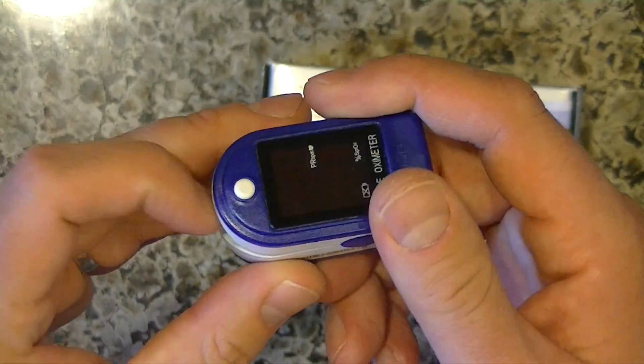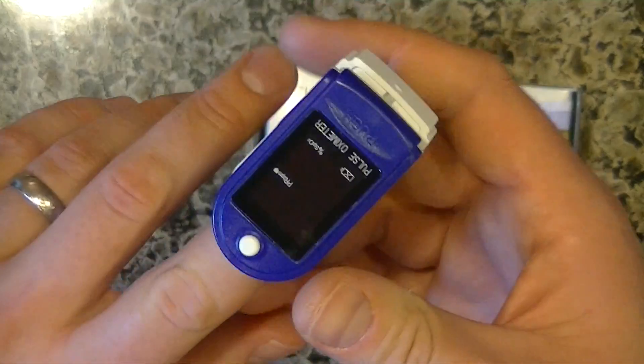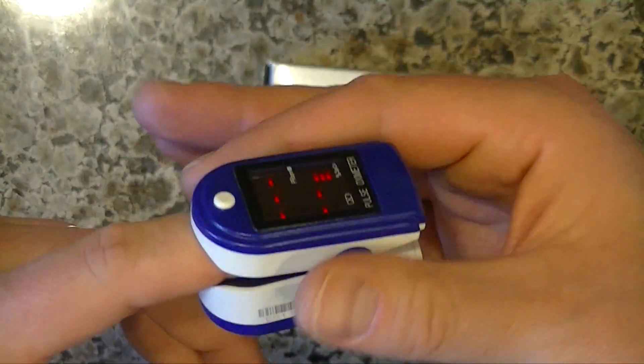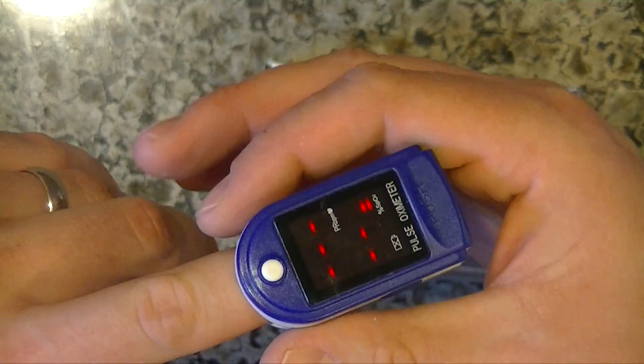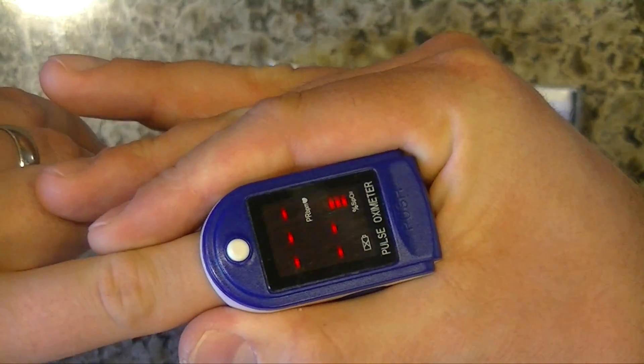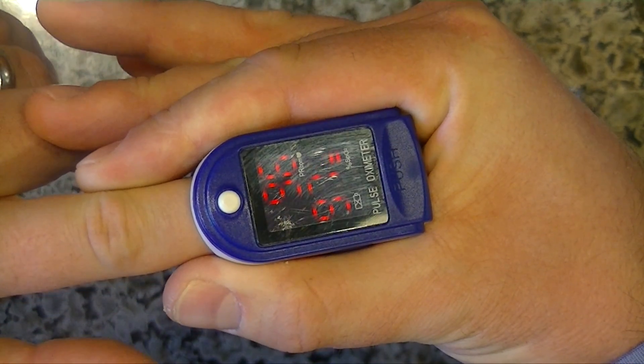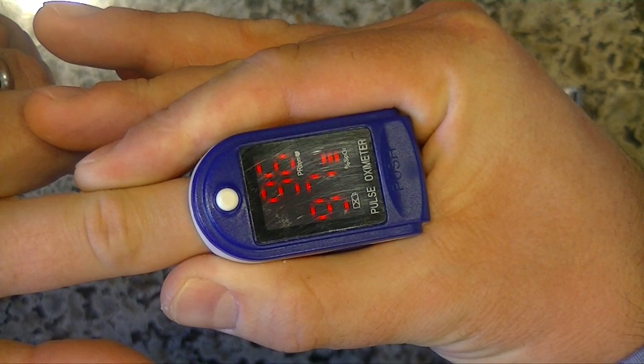I will say that it works better in a dark environment. The one that the doctor had had a rubber boot that went over this part so no light would shine, but if you just put your finger over it like that, it can get a more accurate reading.